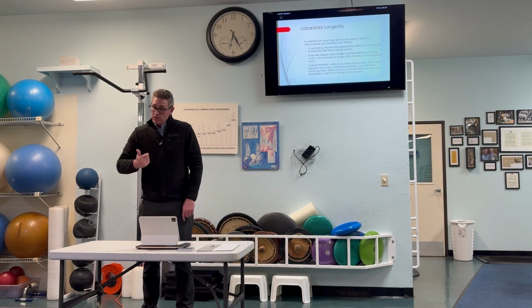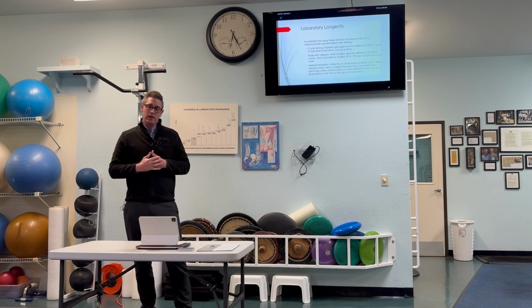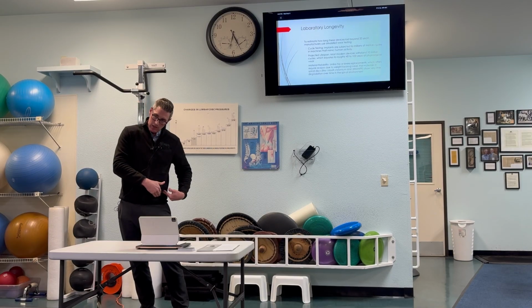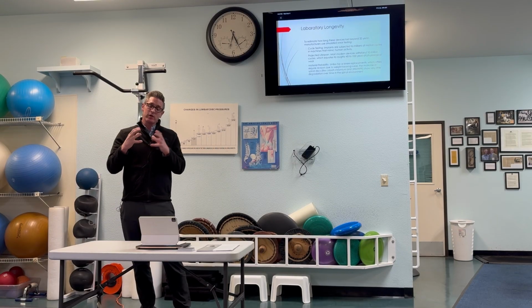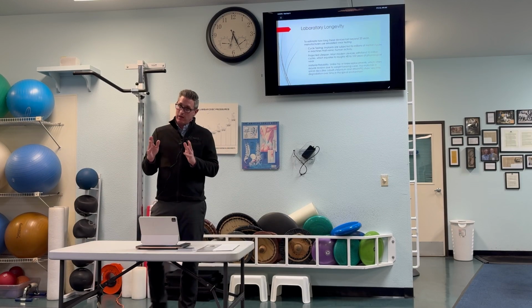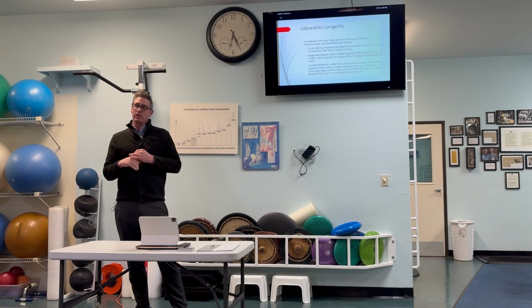And one thing that I always think is interesting is what is the pre-testing, what is the testing that's done prior to these implants getting out? Because as an orthopedic surgeon, we always think about what's the wear, such as in a hip or a knee. More often than not, that has what we call metal on poly or metal on plastic liner, and that plastic can break down, and when that breakdown occurs, that can weaken the bone. Thankfully, that has not happened in the spine, so we don't see a lot of that, what we call osteolysis. So despite having that wear on that plastic, that's still much less of a concern in this regard.